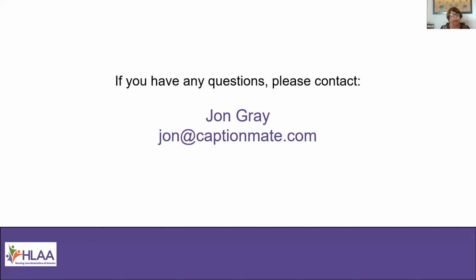I do want to come back just for a moment to talk about using CaptionMate in a group setting live without a phone call. It's not only discouraged, it goes against the FCC regulations. So as John was saying, CaptionMate is for telephone calls and telephone calls only. So it's not appropriate for use in a classroom or a social setting where there's not a telephone call being made.